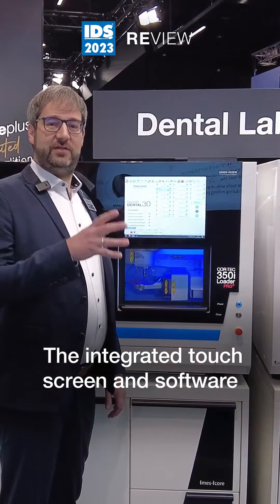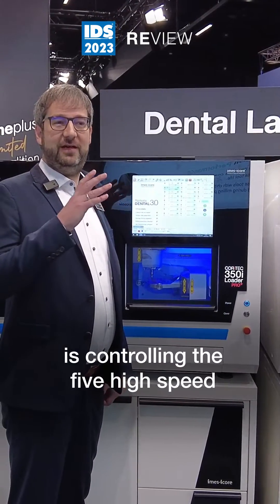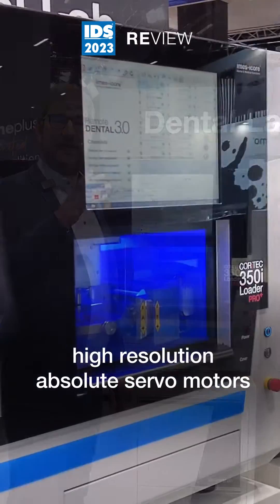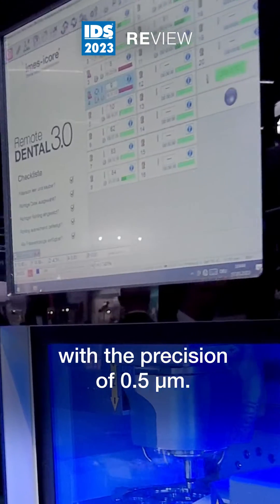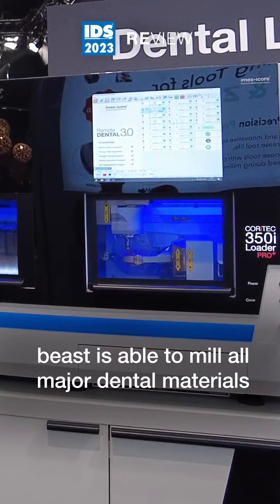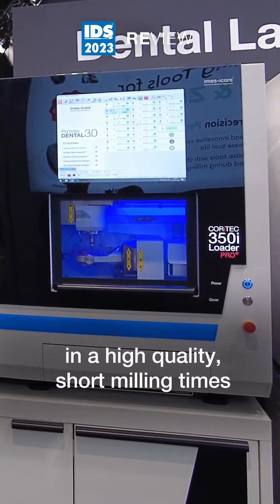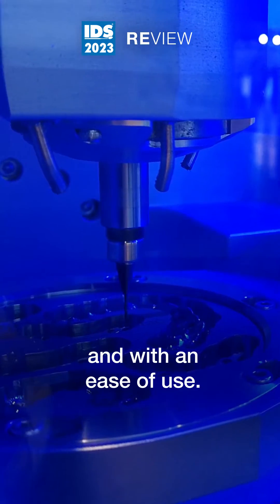The integrated touch screen and software with the user interface controls five high speed, high resolution absolute servo motors with a precision of 0.5 microns. So all in all, this massive and high precision machine is able to mill all major dental materials with high quality, short milling time, and ease of use.